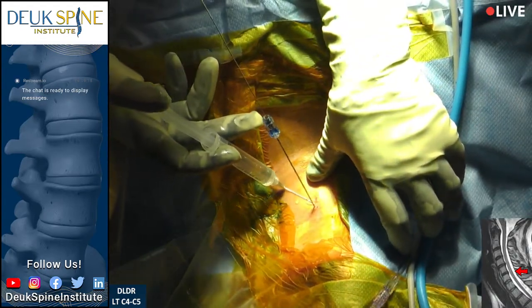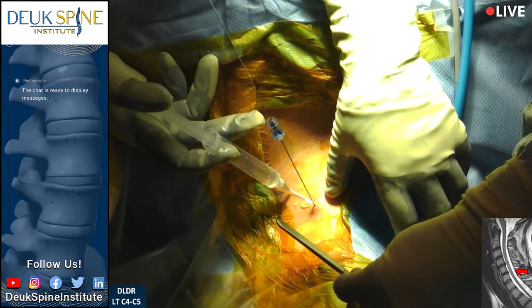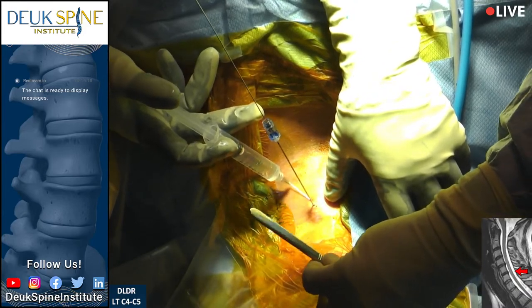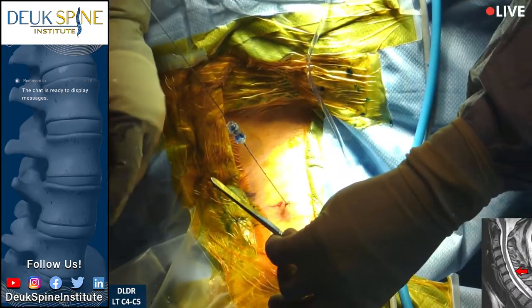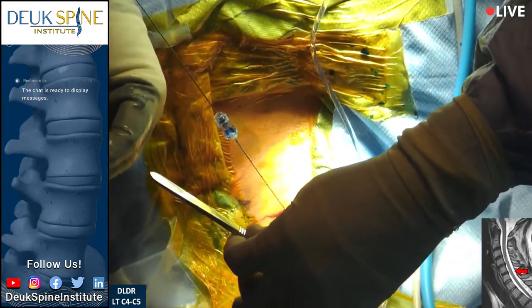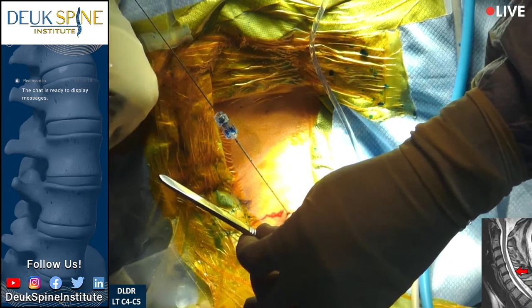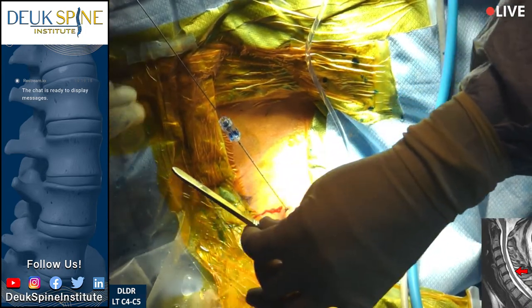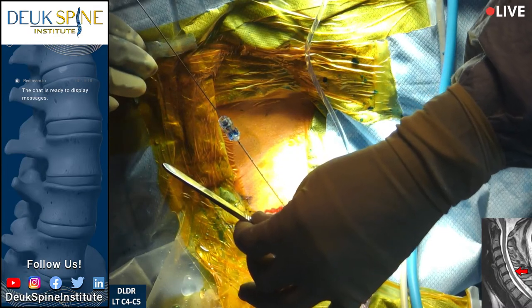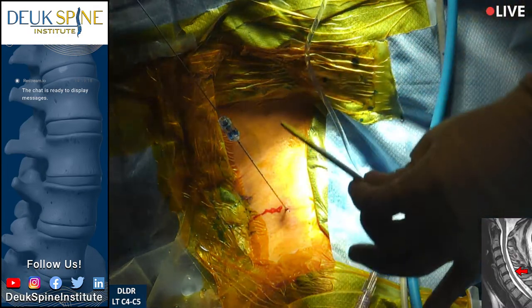We do a little local, and the problem is the dye is very sticky so I need to get it off my gloves, otherwise everything will stick to my gloves.